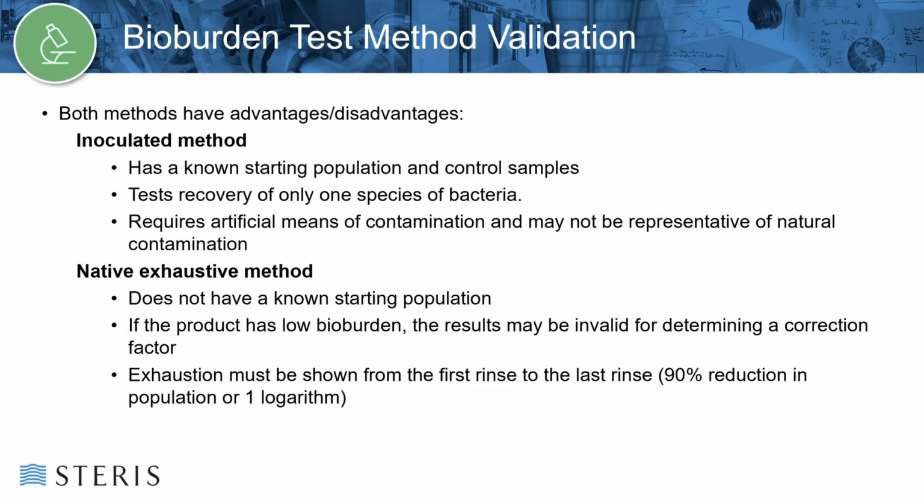Additionally, if there is potential for inhibition of microbes in the bioburden test, additional testing may be needed to screen for adverse substances and ensure those substances are neutralized for the enumeration of bioburden.